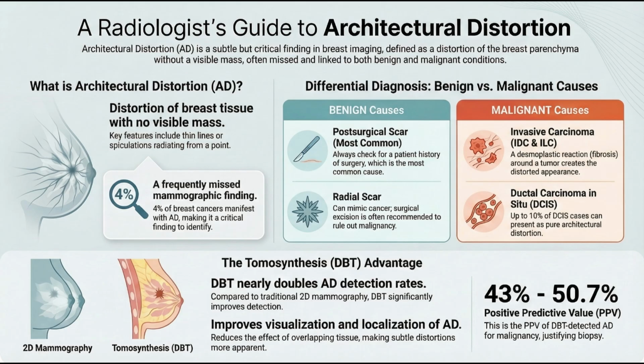And things like MRI or contrast-enhanced mammography are usually reserved for cases that are still truly indeterminate, especially when you're dealing with very dense breasts. And the goal of all this imaging is to characterize the finding, right? Is it standalone, or is it associated with other suspicious features? Exactly. We're on the lookout for those really suspicious features: high-density distortions, clustered microcalcifications, angular margins on ultrasound, things like that. These factors all inform the initial suspicion level and the BI-RADS category we assign.